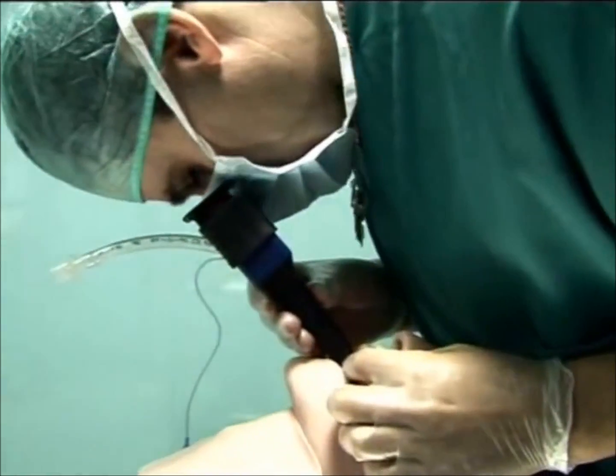Look through the eyepiece to identify the airway structures. If you can't see the landmarks, withdraw a little and pull up the air-track. Do not insert too deep.